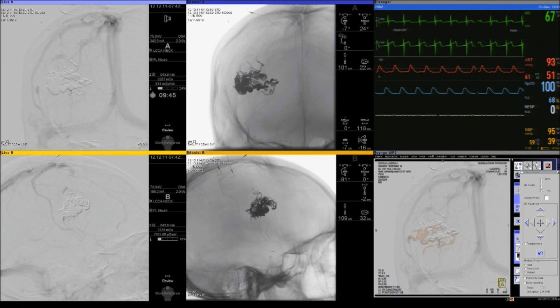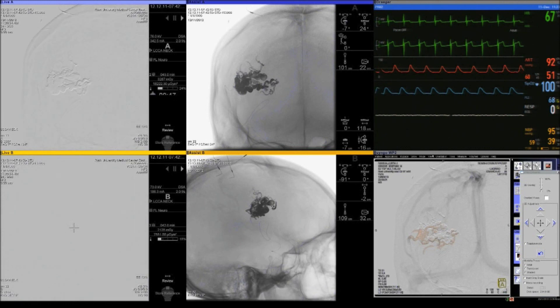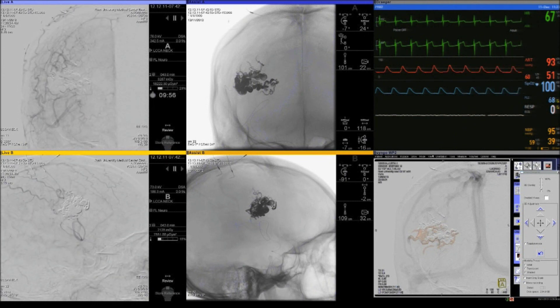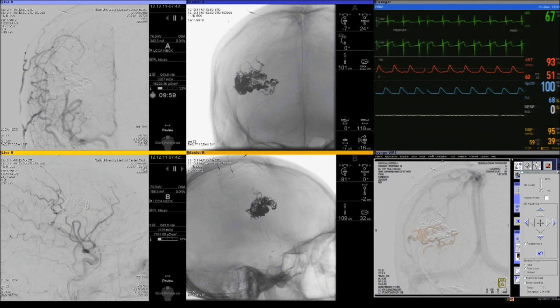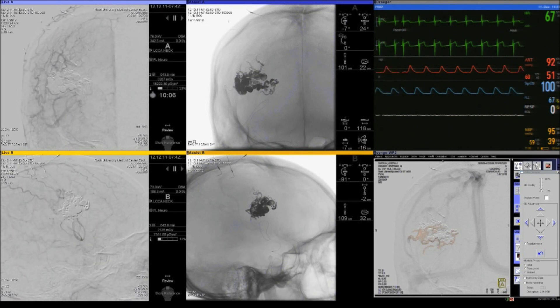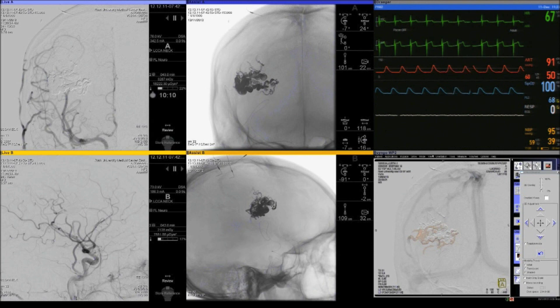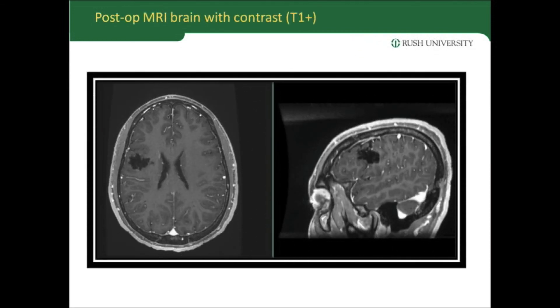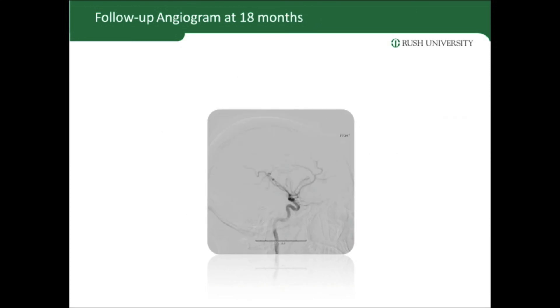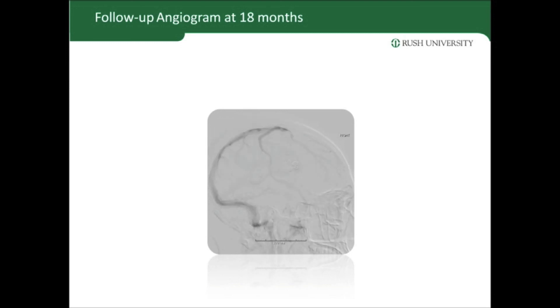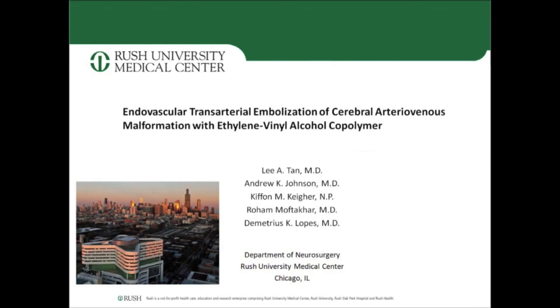These AVMs are only considered cured if there is complete angiographic occlusion as well as MRI evidence of no contrast inside the Onyx cast or what used to be the nidus. Before considering this AVM successfully treated, confirmation with MRI is extremely important. This patient did very well and was discharged home within three days. This is the MRI confirming occlusion of the malformation and the follow-up angiogram at 18 months. We don't necessarily advocate removal of these AVMs if they remain occluded — we keep follow-up with MRIs on a yearly basis.